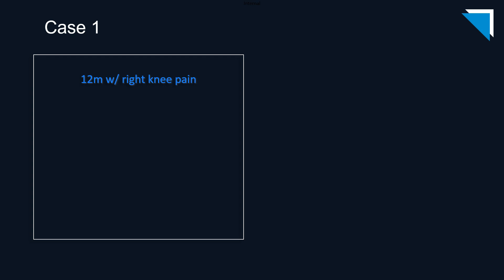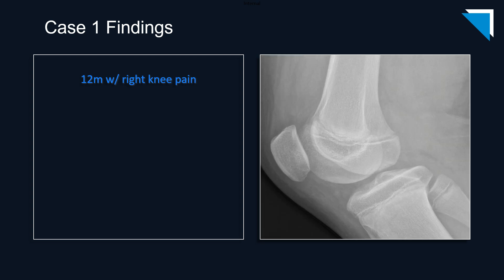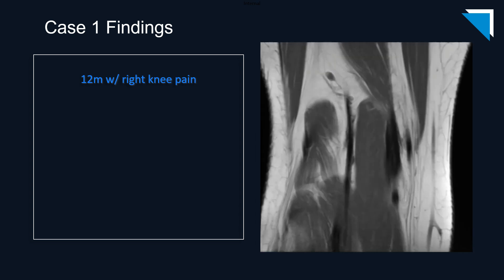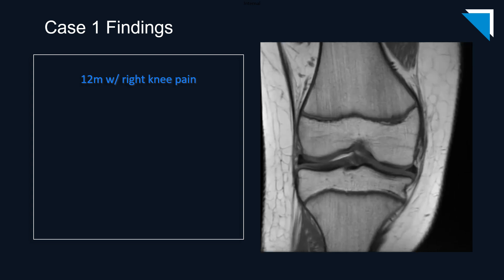Our first patient is a 12-year-old boy with right knee pain. Here is the AP radiograph of the right knee and the corresponding lateral view. An MRI of the knee was subsequently obtained. Here are the coronal T1-weighted images.